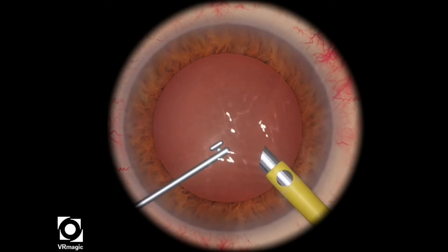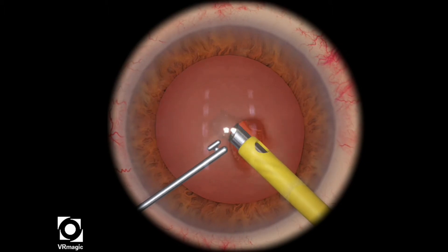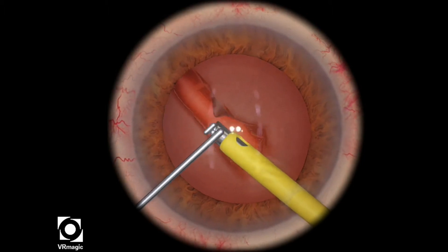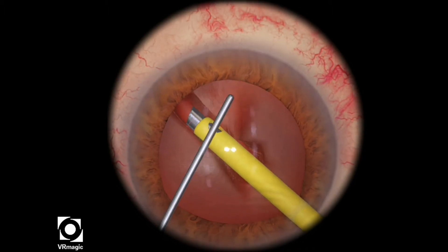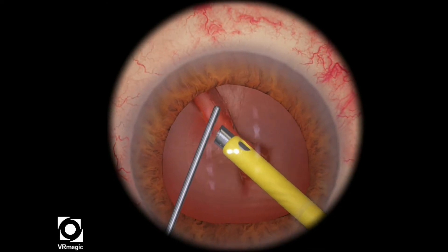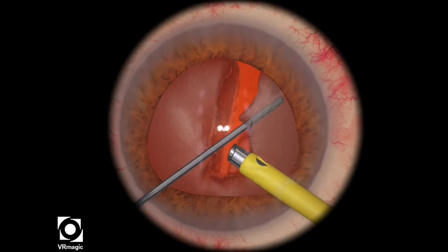This level is actually quite challenging, not because of the cracking part, but actually because of the sculpting part. The machine will deduct a lot of points from you if you don't use a very limited amount of ultrasonic energy. In addition, the lens is quite soft, so it's actually quite hard to propagate a crack completely.